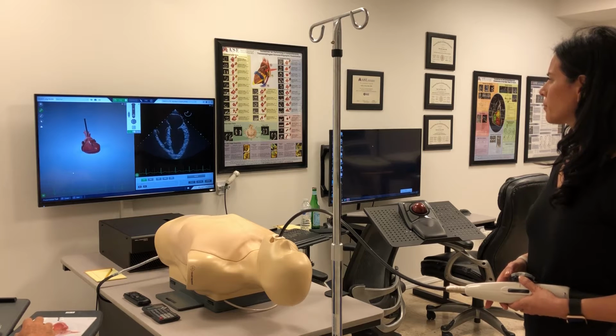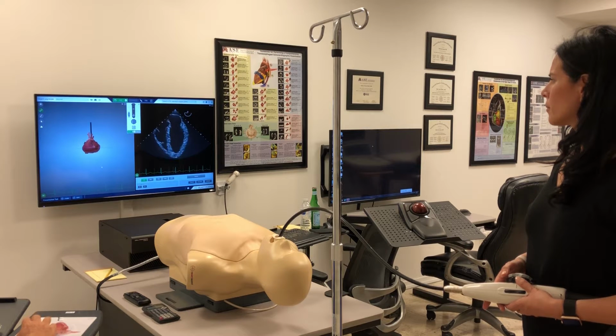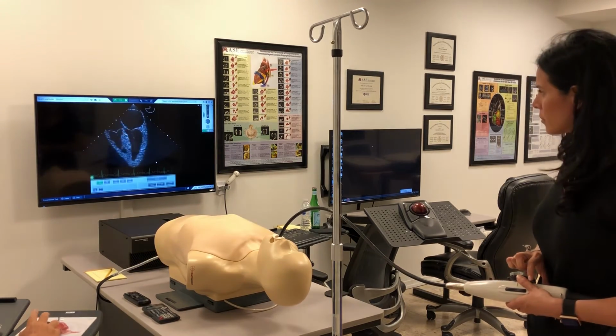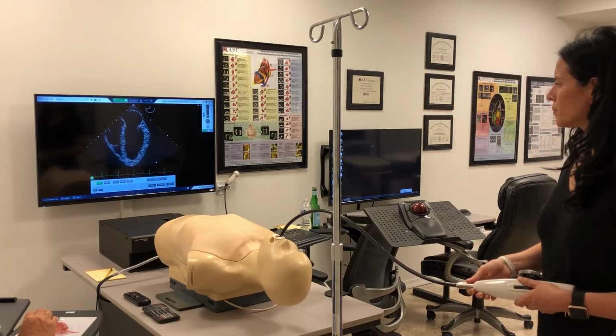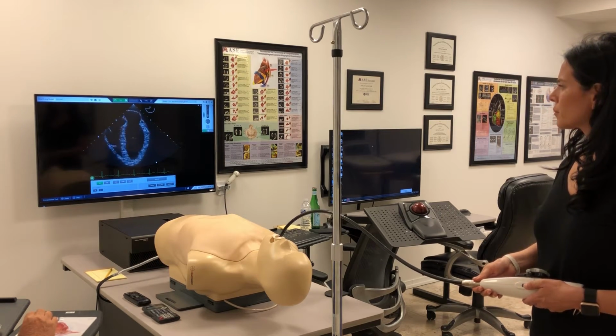If you look at the external view of the virtual reality, you can see that you're just right through the apex of the heart, and that gives you that perfect non-foreshortened view that you have right now. So at this point, I would go ahead and lock the big wheel to keep that degree of retroflexion. Good. So this is perfect mid-esophageal four-chamber view.